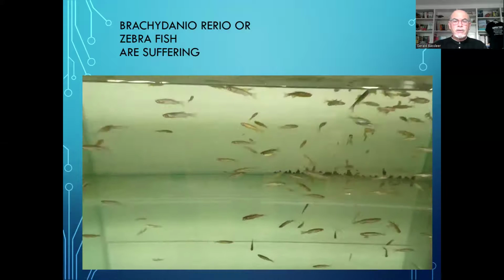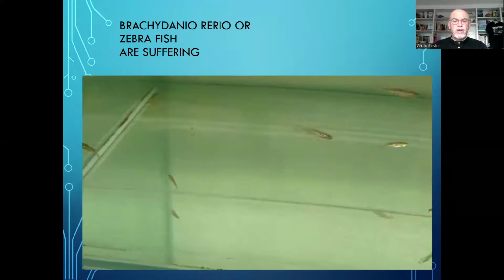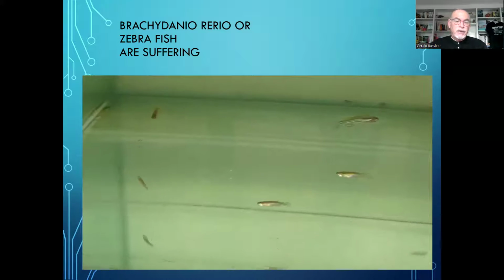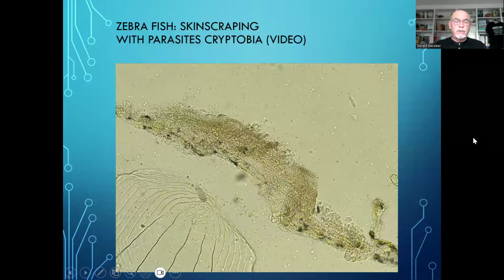Here we observe the zebrafish in the aquarium. You see the few skinny ones that are suffering, wasting away, becoming very skinny, not eating well, and dying. So that is, of course, the moment you have to take your microscope and examine what you found.